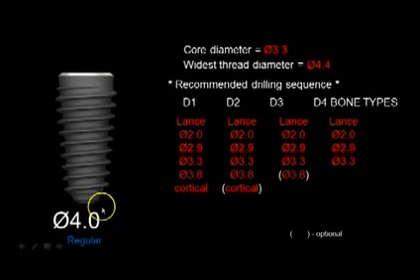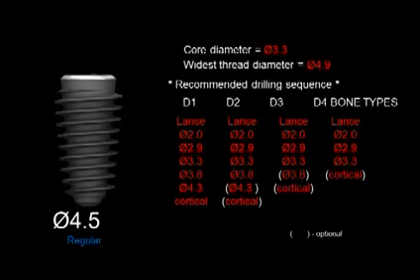Because remember, we talked about earlier, you almost want to drill out for your dense bone protocol. You want to almost drill out to the final diameter or width of the implant. So the implant diameter is 4.0. By the way, the circle with the line through it means diameter. 4.0 diameter. So we're going to stop at our 3.8 final drill and then use our cortical bone drill and then place the implant. So notice we're almost at the end of the final diameter. And that's what that dense bone protocol meant earlier.